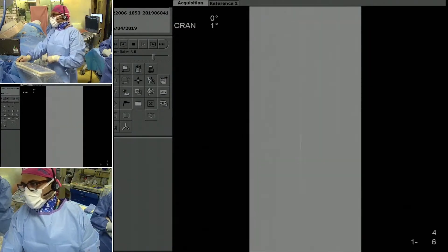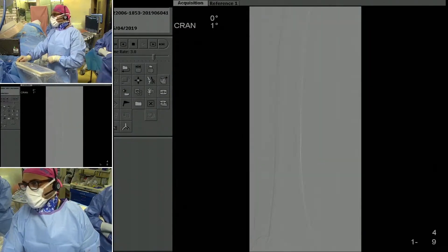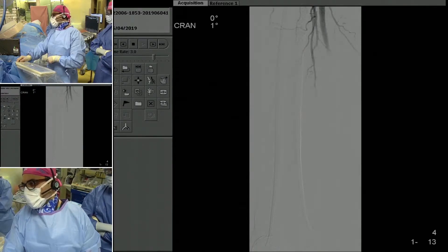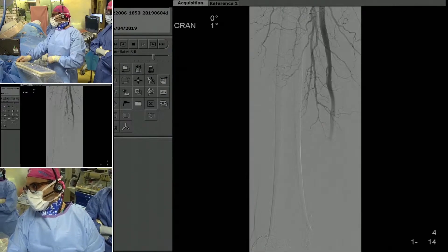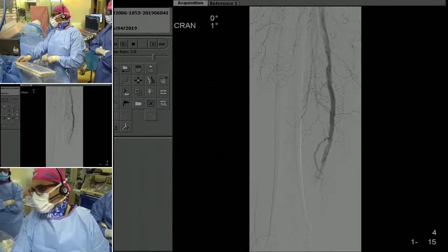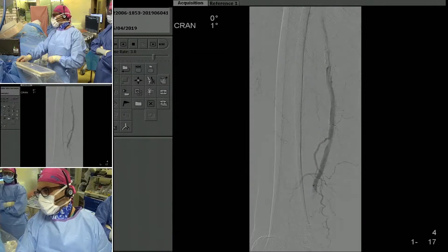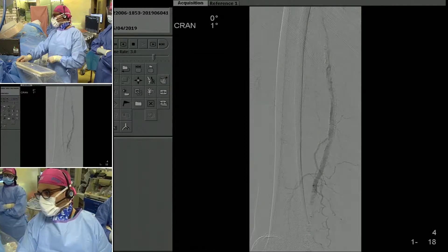When you get down to the level of the popliteal artery, we have two occlusions.